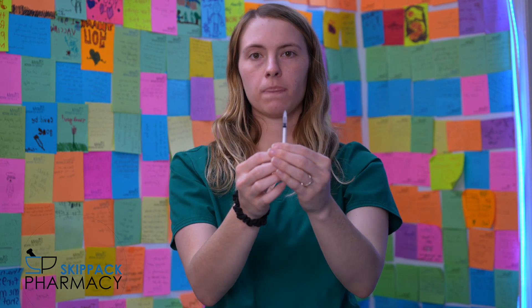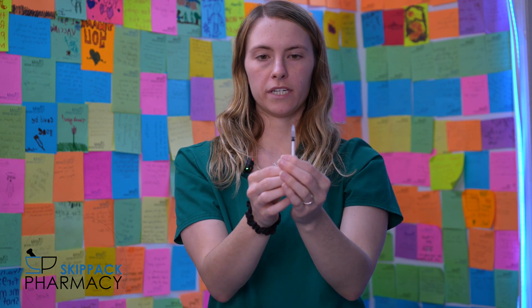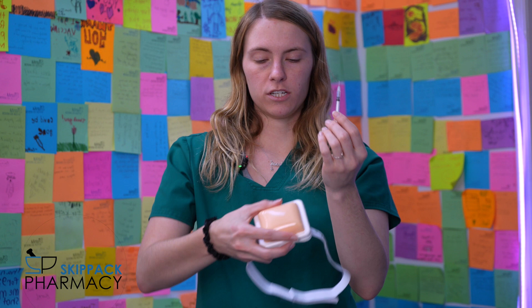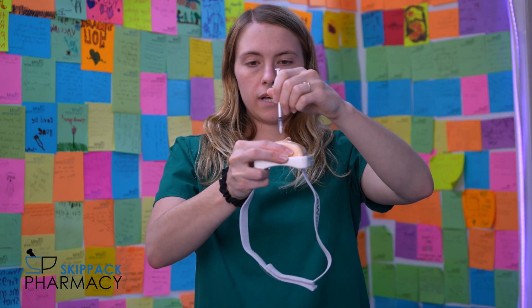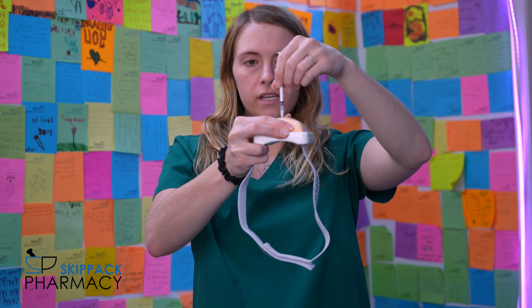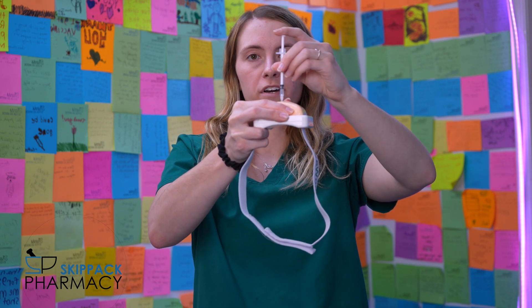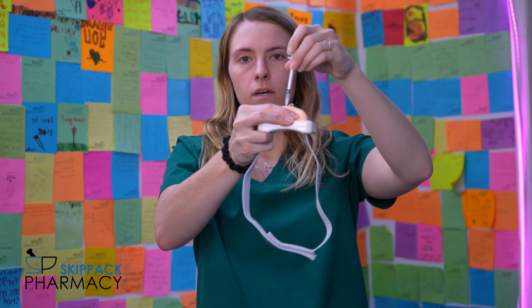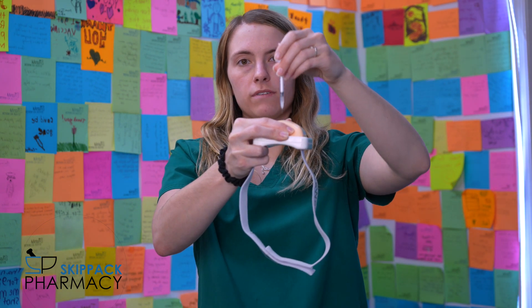Since you cleaned your site earlier, just make sure that it's dry — if there's any alcohol left over it could burn. Next, pinch your skin with your index finger and your thumb, and stick the needle at a 90-degree angle into your skin. Then expel all the contents of the needle into your skin and make sure the plunger is all the way at the bottom.